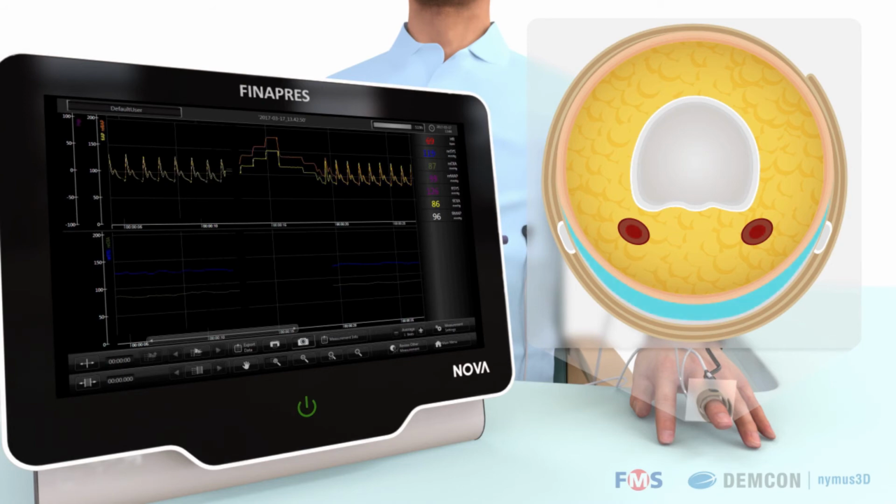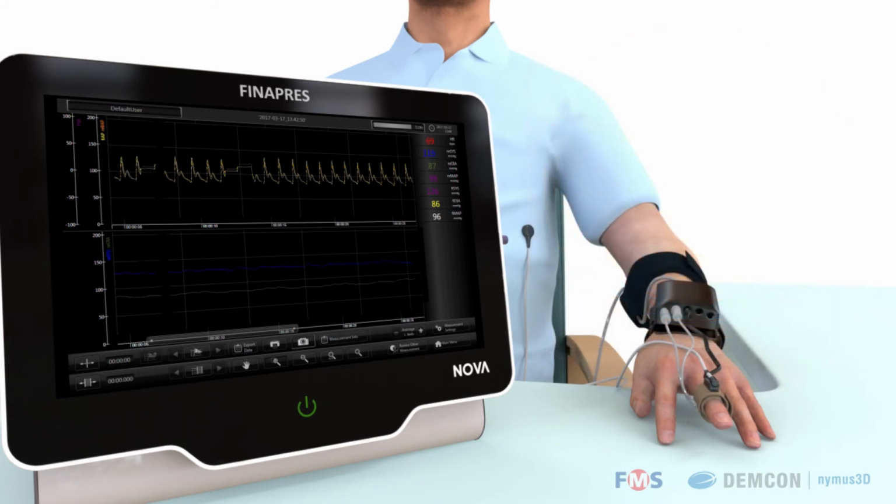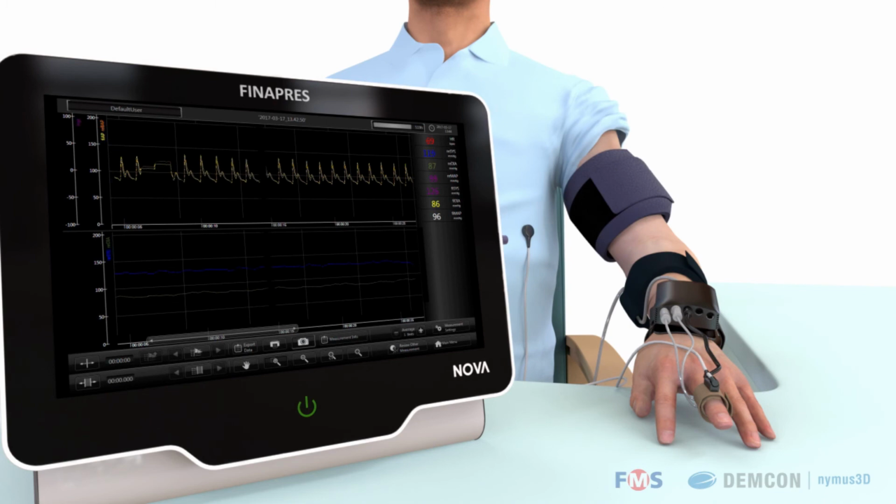Consequently, the pressure inside the cuff that is needed to maintain this equilibrium resembles the arterial blood pressure in the finger. The Finapres Nova also calculates brachial pressure from the measured finger pressure. An arm cuff is used for only a one-time calibration of this calculated brachial arterial pressure.